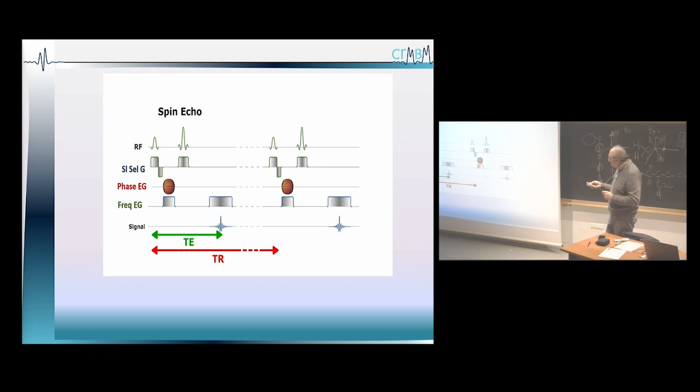So we're going to put on top of the frequencies in here what we call the gradient. The gradient, as I said, is going to change the precession frequency of the nuclei as I want. I'm going to decide that in the middle, the frequency will be 1, and on the upper left, it will be 2, and on the upper right, it will be -2.